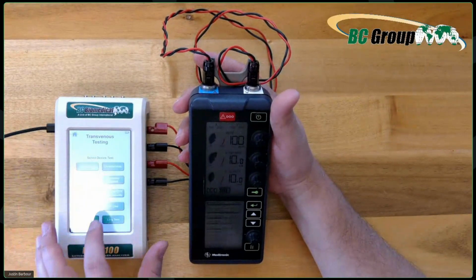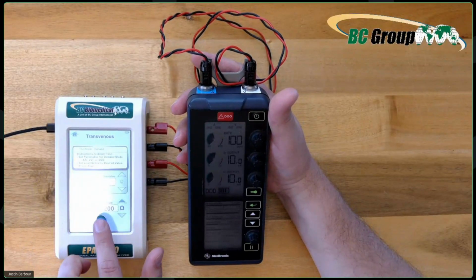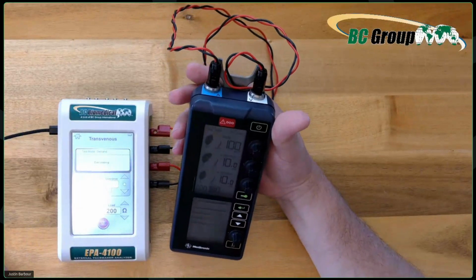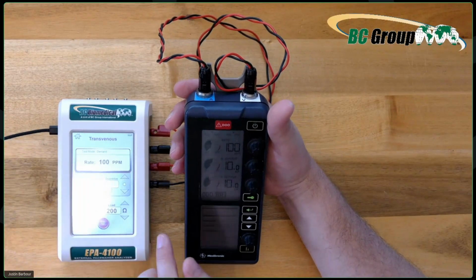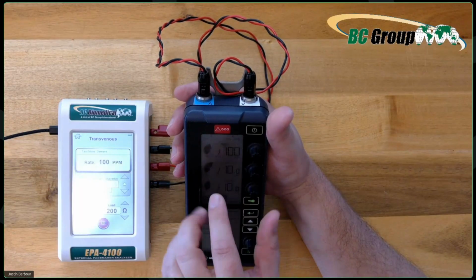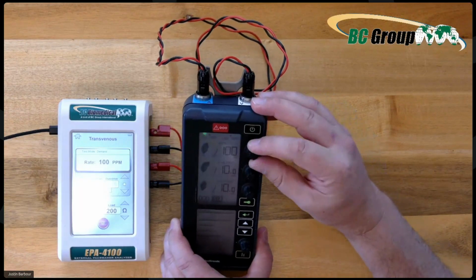Yeah, transvenous, demand mode. What we can do here is we hit start and it automatically calculates what your pacer is doing. So you can see right here, it says, hey, you're at 100. You can underdrive and overdrive, and you'll see the blue lights flashing up here, which means it is sensing that the heart is trying to do something.